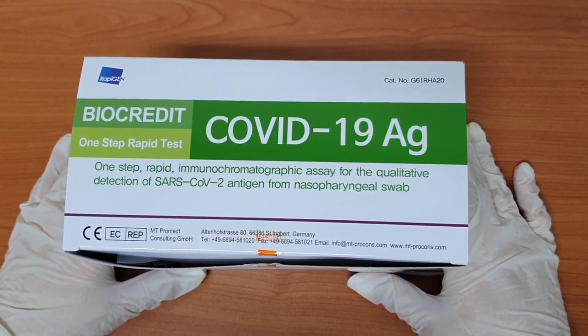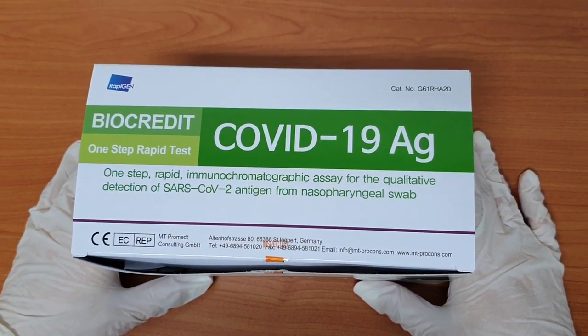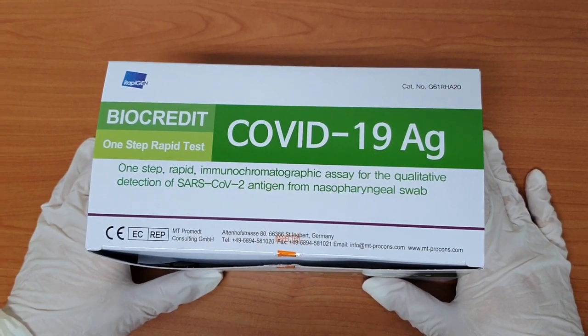It is a one-step rapid immunochromatographic assay for the qualitative detection of SARS-CoV-2 antigen from nasopharyngeal swab.